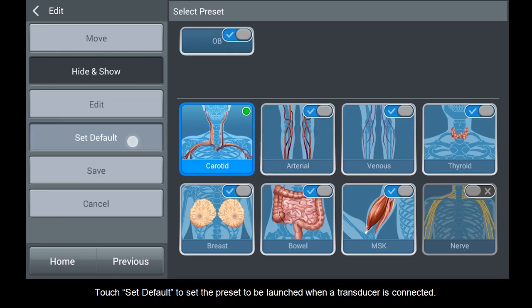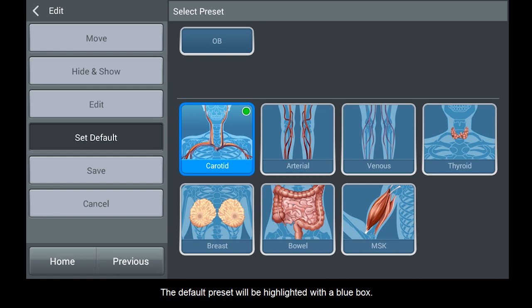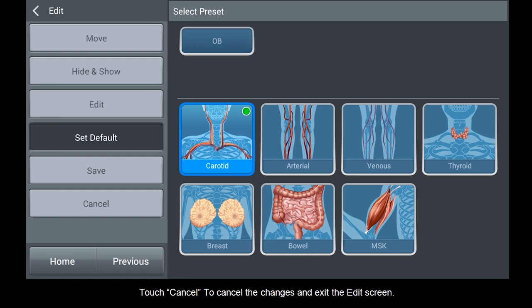Touch Set Default to set the preset to be launched when a transducer is connected. The default preset will be highlighted with a blue box. Touch Save to save changes made to the presets. Touch Cancel to cancel the changes and exit the edit screen.